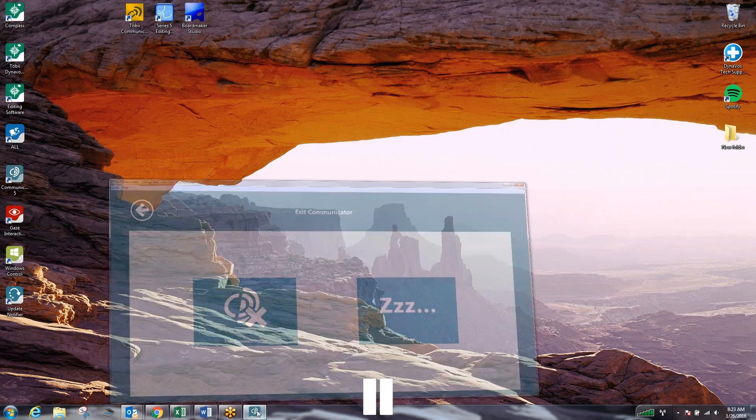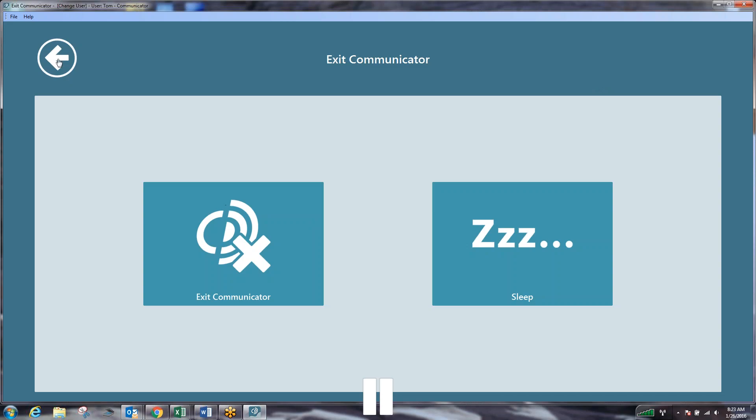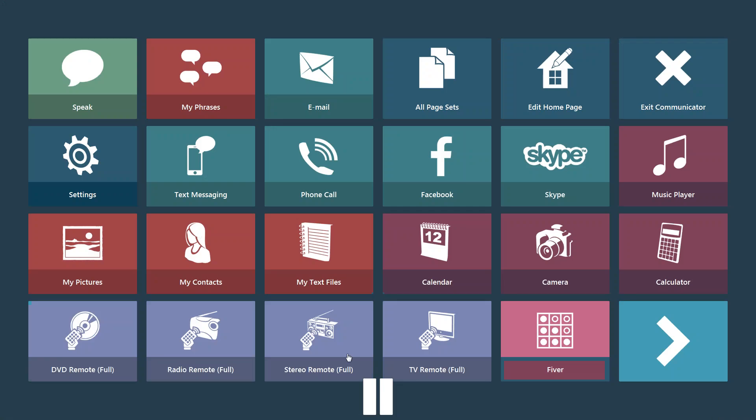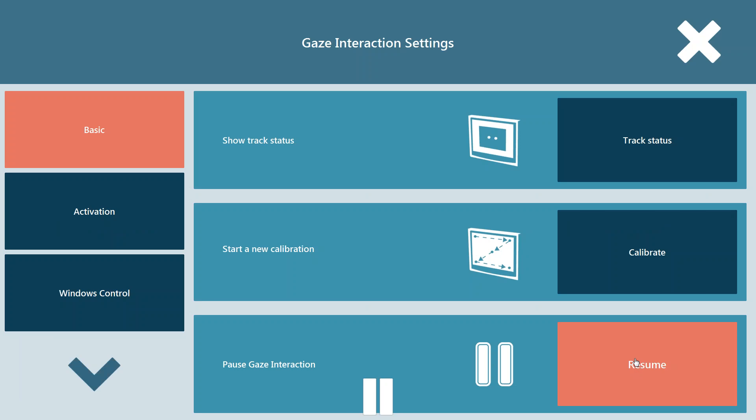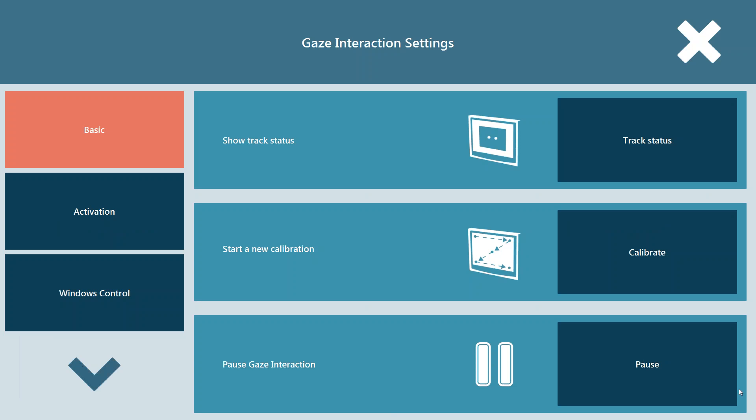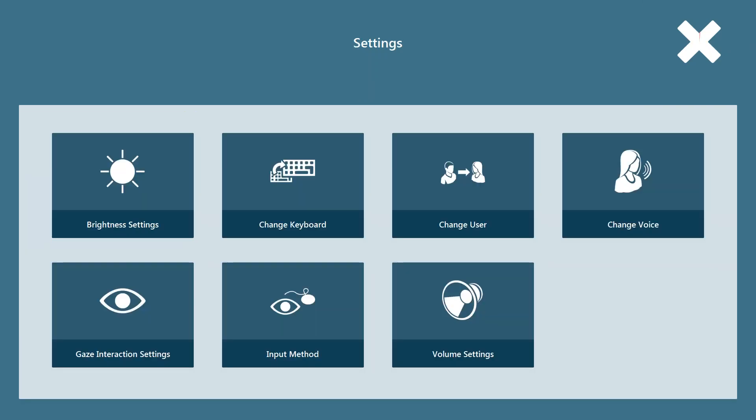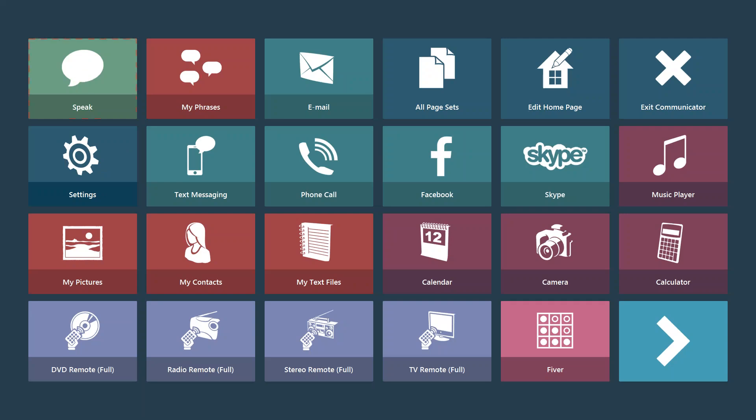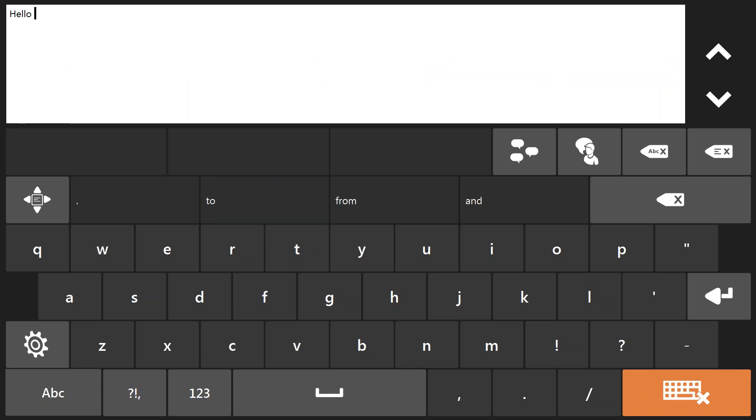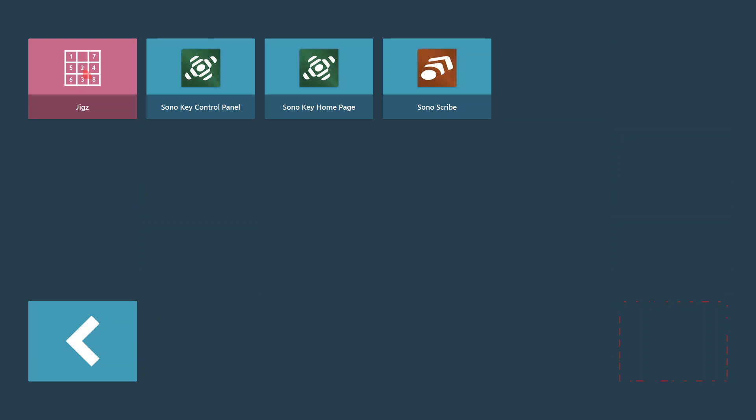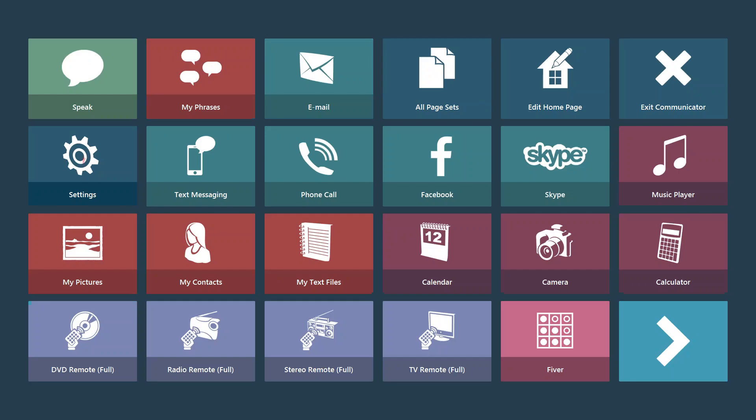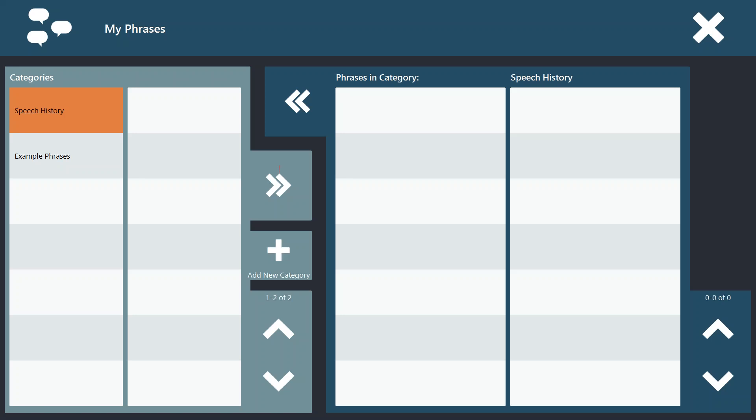If we're happy with our calibration we're going to hit okay down here in the corner. We're going to go back into our speech software. At this point I have myself currently paused. What we can do to unpause is go into settings, gaze interaction settings, and we can click resume. So now right now I should be navigating with just my eyes. As you can see me controlling the device right now, I am using just my eyes to do this. So I'm just going to try and type hello. And there you go. At this point I am live with my eyes, we are navigating through, I can get to any location of the screen I want. This is what you would want to check with your customer or with your loved one to make sure that they can get where they want to go with as little frustration as possible.